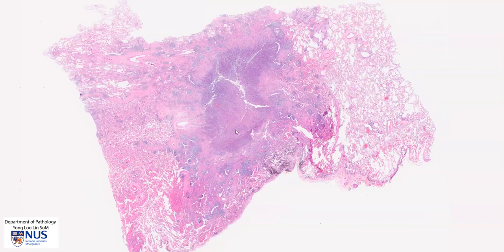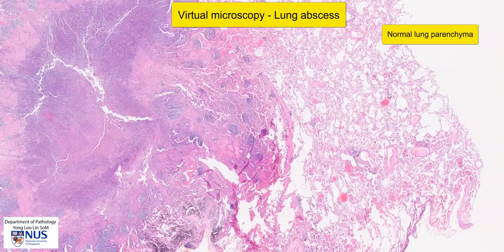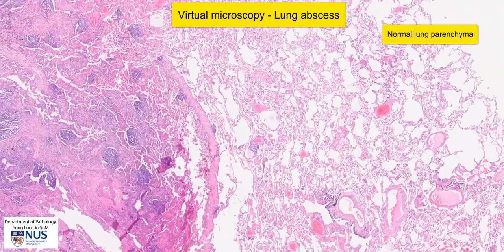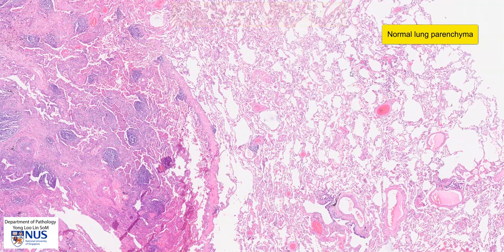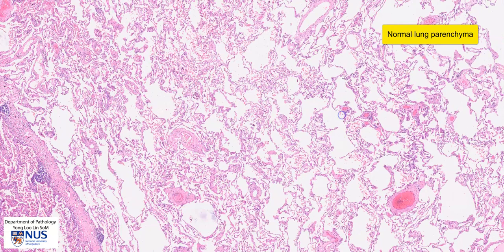This is a virtual microscopy slide of the lung showing a lung abscess. On the right, we have the relatively normal lung parenchyma, which tends to have this spongy appearance because of the air spaces. We can see that the alveolar septae are very, very thin.